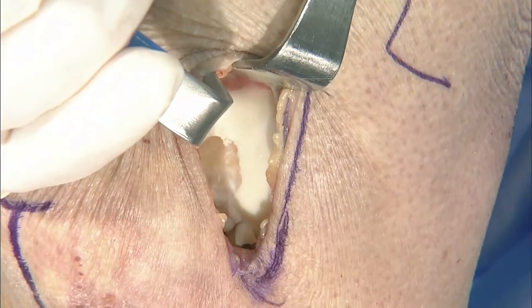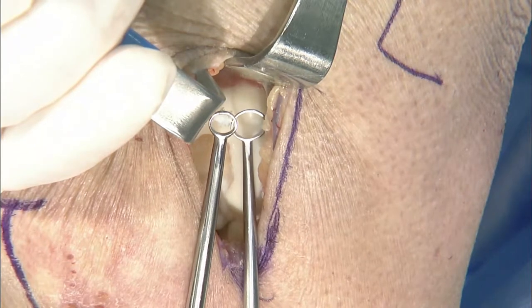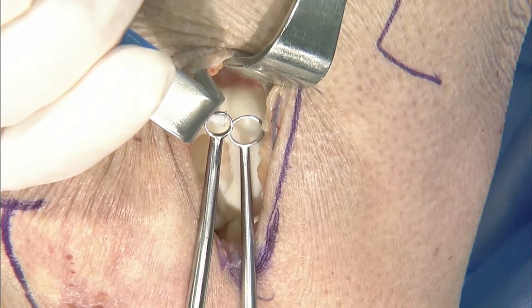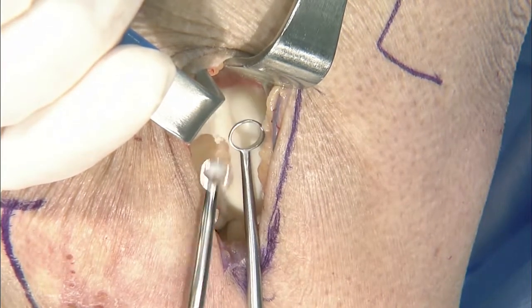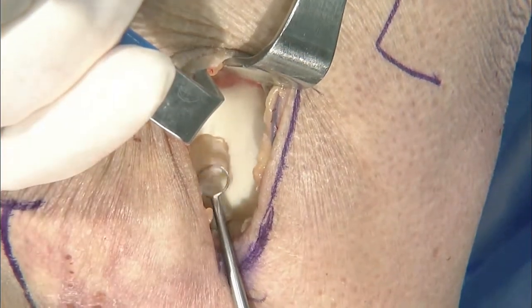And then after you get the defect totally prepped, you can go to a smaller diameter ring curette or a regular curette, and the same amount of force will have a lot more pressure, and then you can start to remove the calcified cartilage layer, which we'll talk about too. So there you saw it. Jeff was comparing some of the sizes.